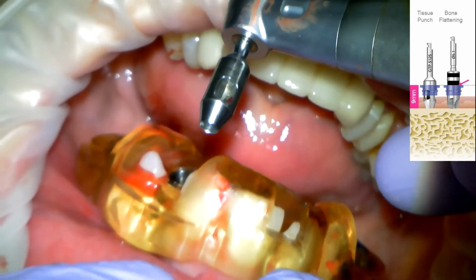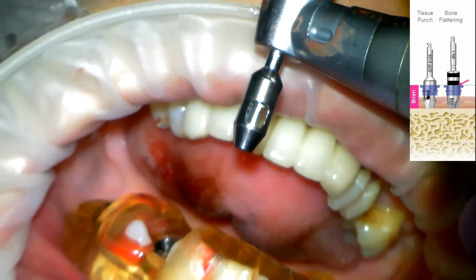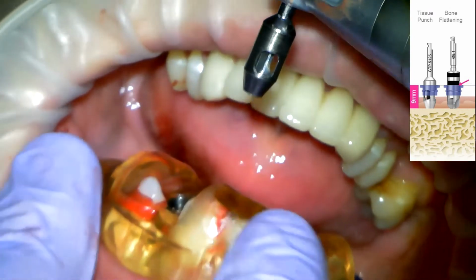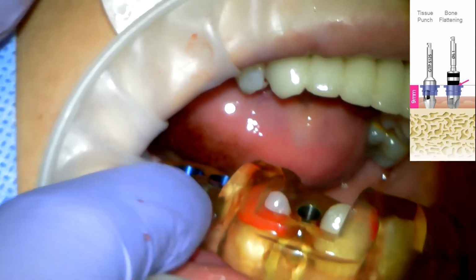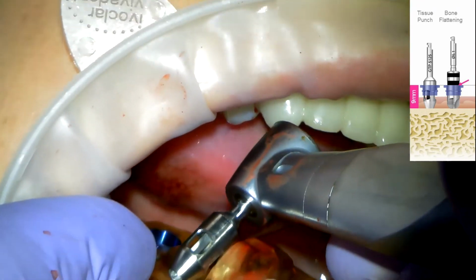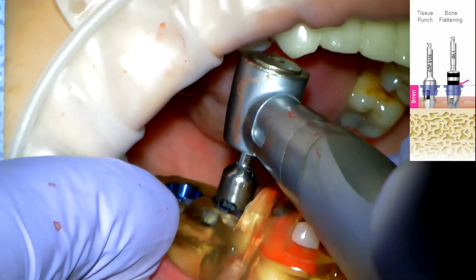Because the tissue punch and the bone flattening drill are the same for 13 and 14, I will go ahead and use those both at the same time. So I'm going to go 13, 14 here. Go ahead and turn way to your right. Way over and real big. Is that as big as you opened? Uh-huh. No.